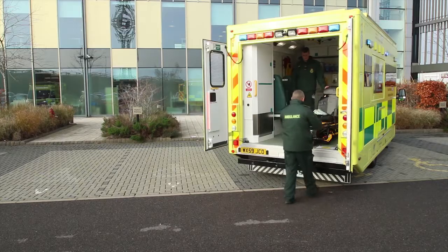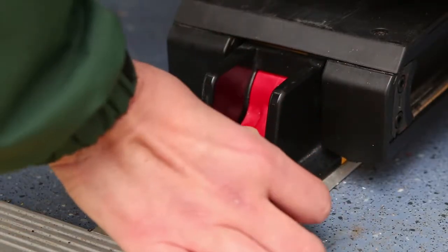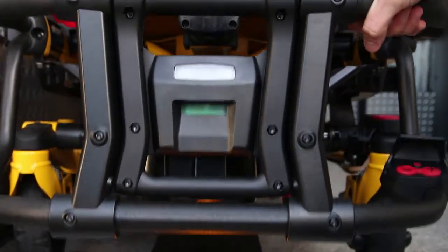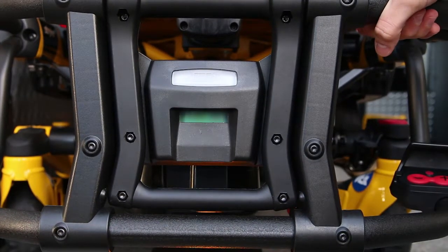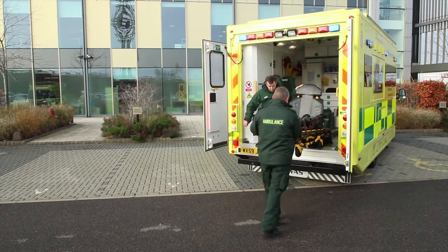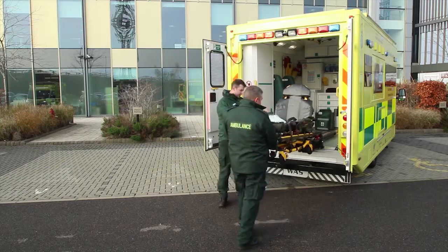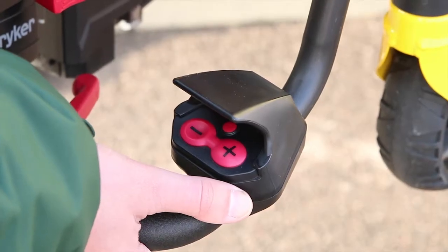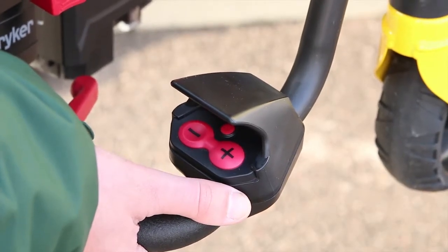To unload the stretcher, press and hold the red release lever at the foot-end of the PowerLoad. The PowerLoad will raise slightly, indicating that it has been activated and is now supporting the weight of the stretcher. Guide the stretcher out until the head-end LED indicators turn solid green, indicating the stretcher is ready to be lowered and taken away from the vehicle. Locate the control panel at the foot-end of the stretcher.